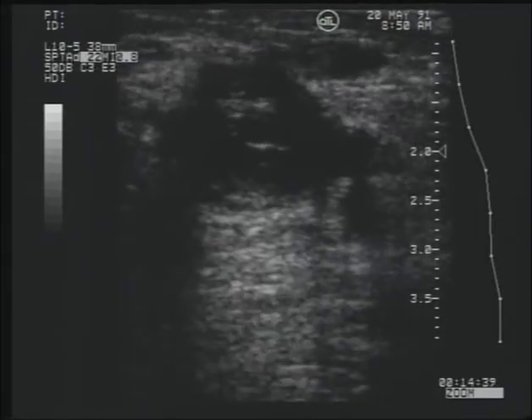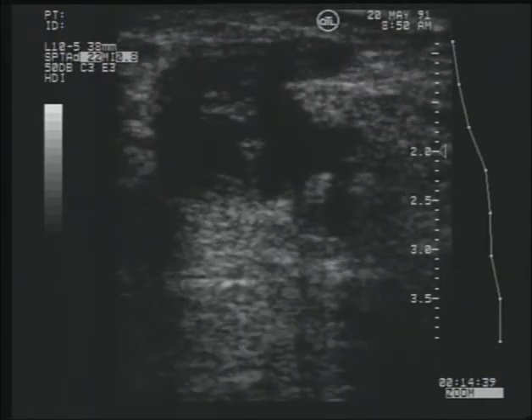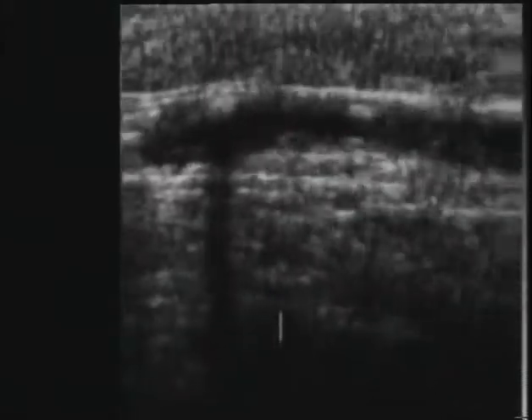As it ages, even a loose thrombus will attach to the vein wall. How securely a thrombus is attached can therefore be another indicator of the age of the thrombus. As clot ages, it becomes more dense and contracted. Therefore, it becomes very solid. Extremely old thrombus may actually become so dense that it creates acoustic shadowing. In contrast to the gelatin-like consistency of newly formed thrombus, older thrombus is firm and rigid.